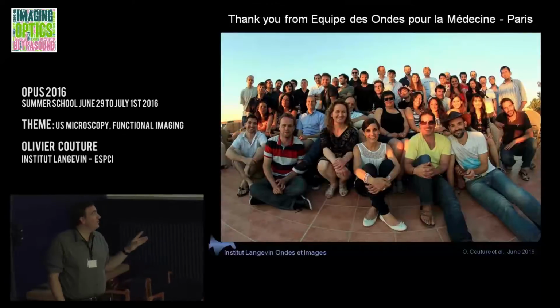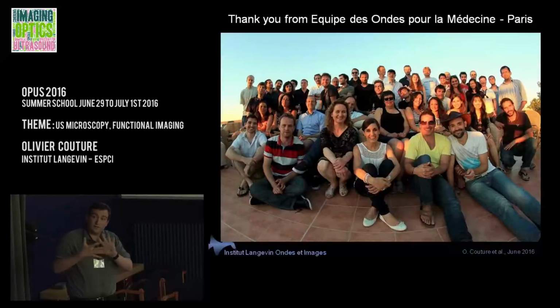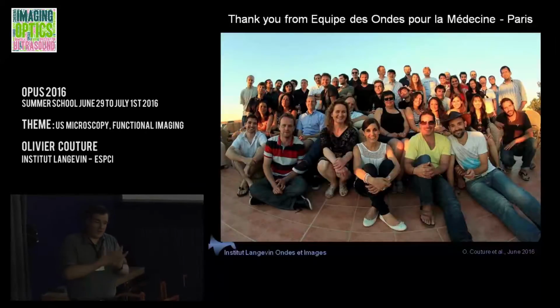But we are currently working on motion correction. It works because, for example, when I show you elastography, it relies on very fine motion that you detect caused by the shear wave. That proves you can find motion much smaller than the wavelength at every point on your image. Since we have this very large stack of data before we use these filters, we can find the motion of the entire image at every moment with a resolution much smaller than the wavelength. So we can correct each image from each other. And then every time we find a bubble, we recorrect its position with respect to that motion.